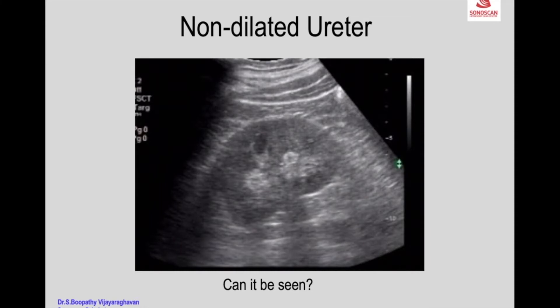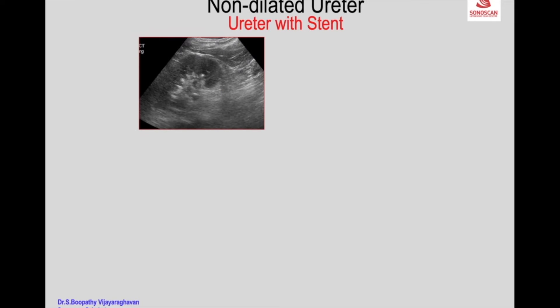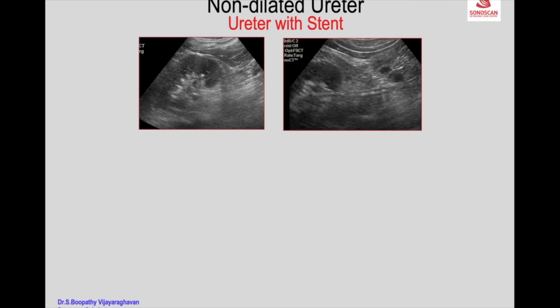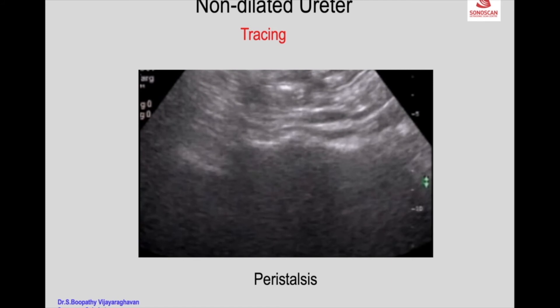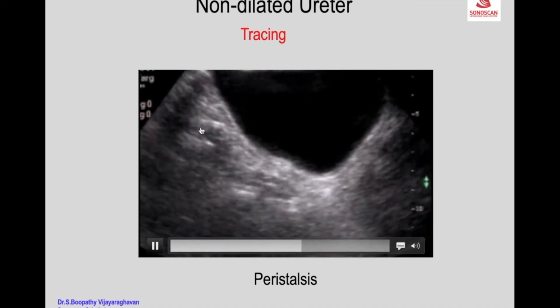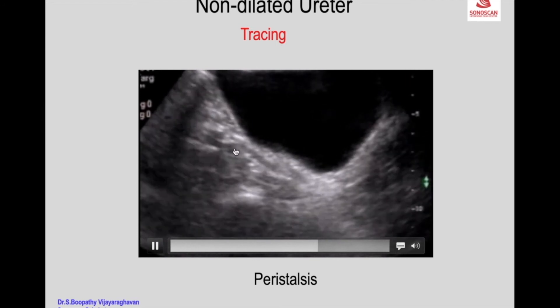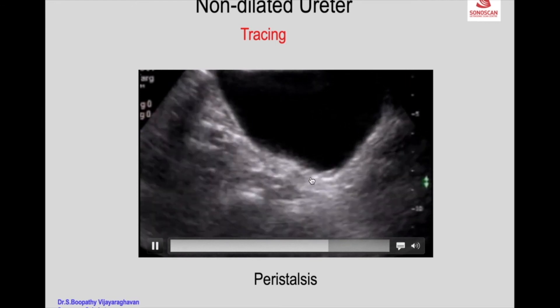Move the transducer to trace the different parts of the ureter. You can also try with the ureter with a stent in place and then see the stent in the renal pelvis. In the upper ureter you can see the stent. By tracing the stent in a non-dilated ureter, it confirms that you are definitely seeing the ureter. That was the mid-ureter, and you see the lower ureter filling up and then collapsing.